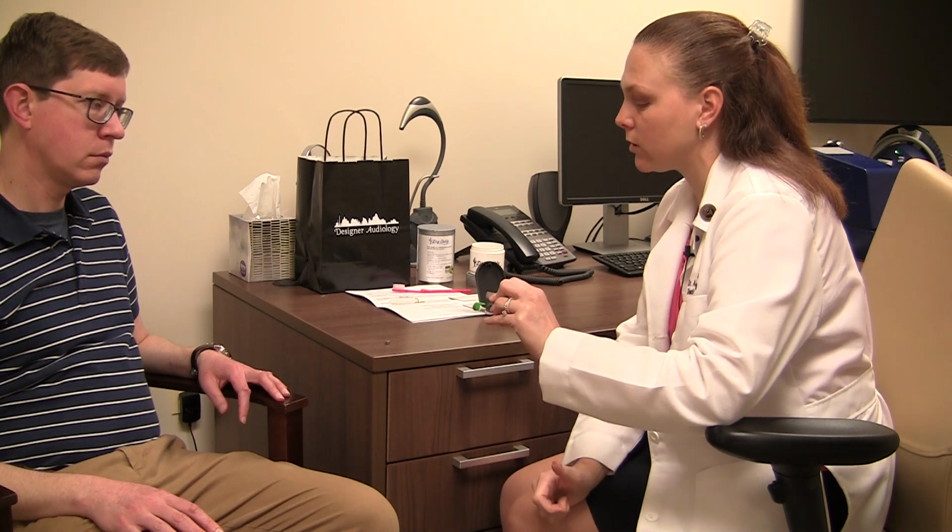On the hearing aid itself, the battery door is at the bottom. And so when we open that door, it's going to turn the hearing aids off because we're going to be able to get to the battery. And when we push the door closed, it's going to turn it back on as long as there's a battery in it. So we're going to practice putting the battery into the battery door.